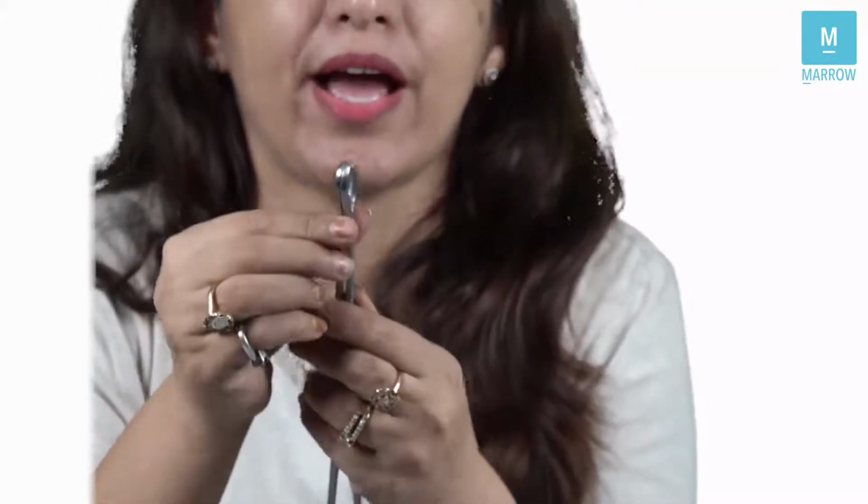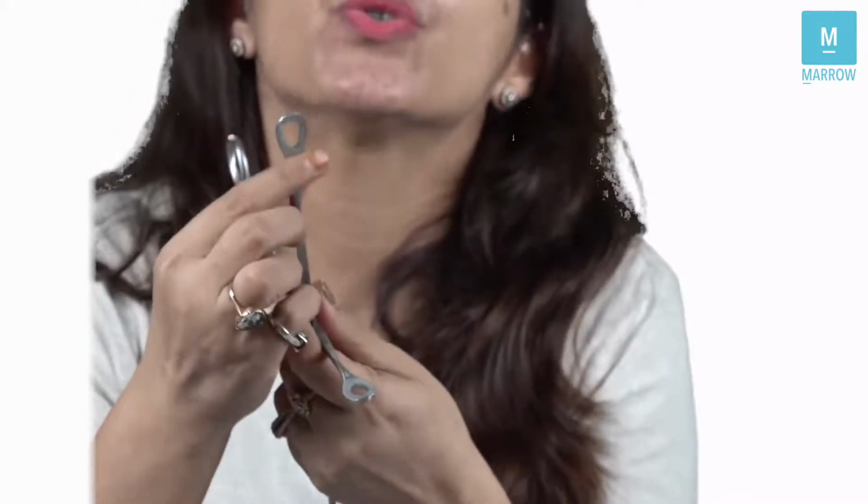Now, if you see its distal end over here, the distal end is ring shaped, right? And when you open the rings, you see serrations present on the rings. So it is ring shaped, it has a hole in the center, and when you open it, you see serrations.